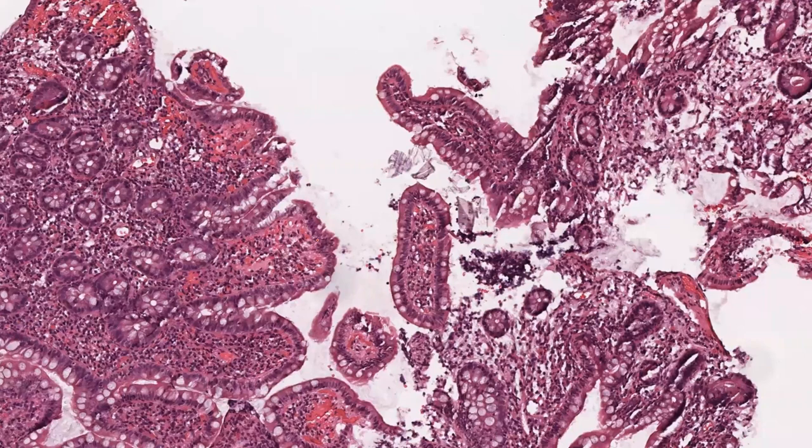If you don't pay a lot of attention to the fact that you still have some villous architecture, you will always call this large bowel. But now, after what we've been through, you know that this was a small bowel that just changed the way it's dressing, yes? It is exactly what it is, yes? But this is what it is.